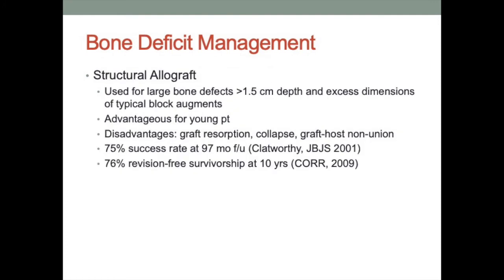Structural allograft can be used for large and structural bone deficits, usually greater than 1.5 centimeters in depth. Again, more advantageous for young patients where you're looking for biologic fixation. The disadvantages: graft resorption, graft fracture, collapse, graft host non-union, and infection.